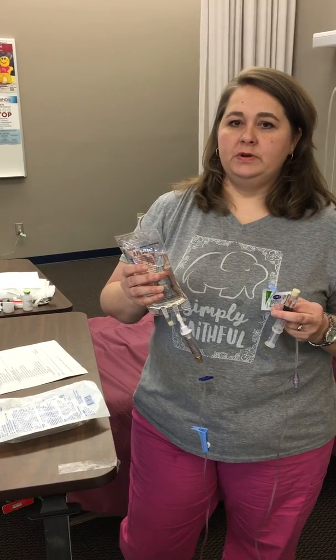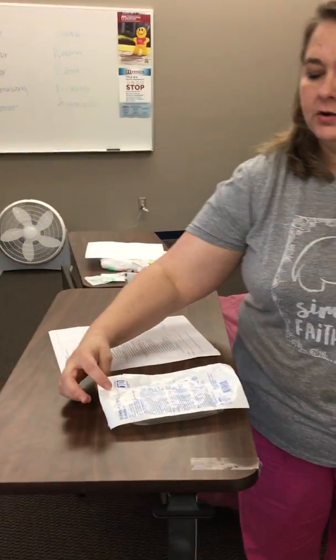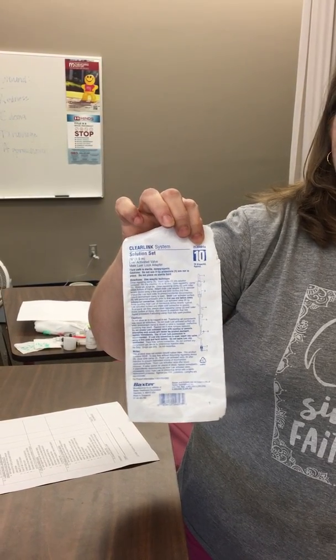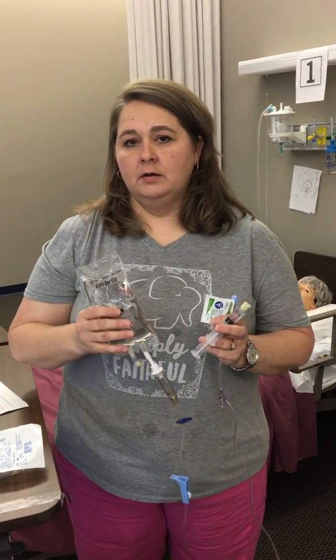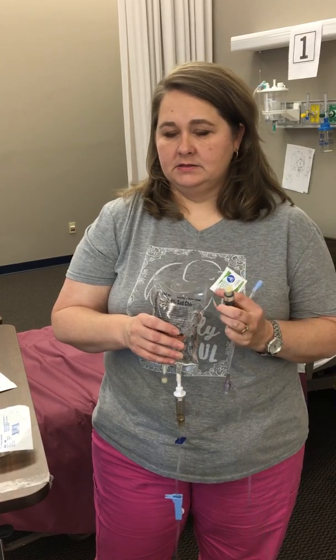At this point we need to calculate our rate of administration, and we want to use our drop factor formula. So be sure to look at your primary tubing set, and the drop factor is listed here. This is 10 drops per milliliter, so this is going to factor in to that formula. I've established my drop factor, and be sure that you state on your video how many drops you're going to let fall every 15 seconds.